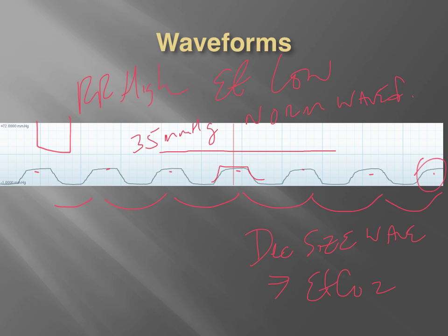This in reality is our typical hyperventilation. We have high respirations and low end tidal CO2, and we have the low waveform, which coincides with that low end tidal reading. In this case, we may have a very regular respiratory rate where we can rely on the numbers on our monitor to be consistent, that rolling average to be consistent with the size of the waveform, which at a glance may be a more immediate recognition of whether or not our end tidal is actually high or low.